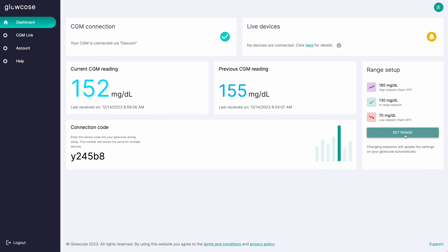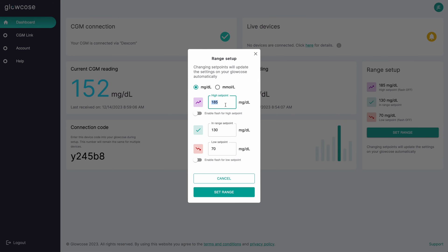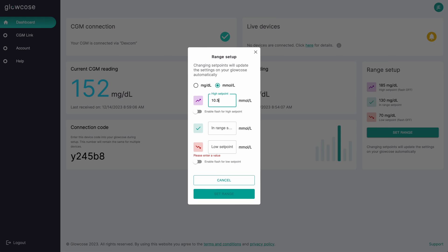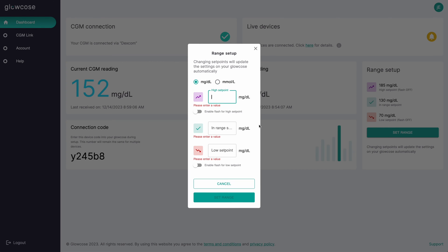Once you set it up, you'll have access to a dashboard where you can adjust controls. The main one is being able to change the ranges — you can set a low, a high, and an in-range level, and the colors will go based off of those. And that's Glowcoast.